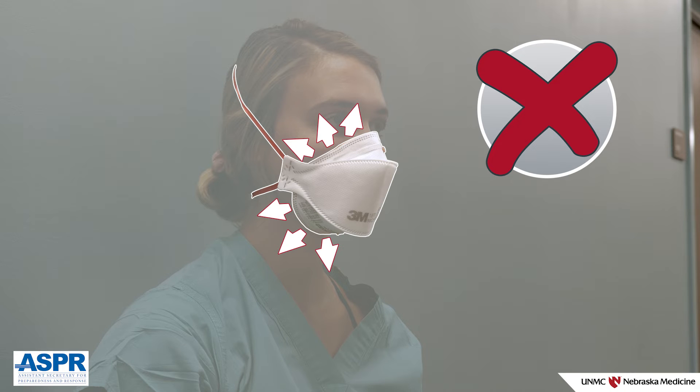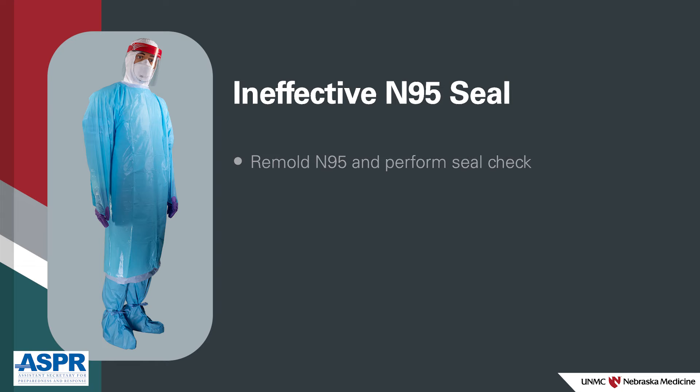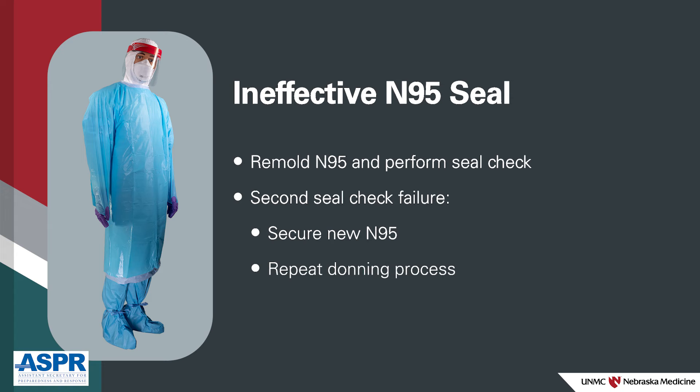If you do experience air movement or fogging, your seal is not effective. At this point, remould the N95 to your face and perform the seal check again. If your respirator fails a second seal check, secure a new respirator and begin the process again.